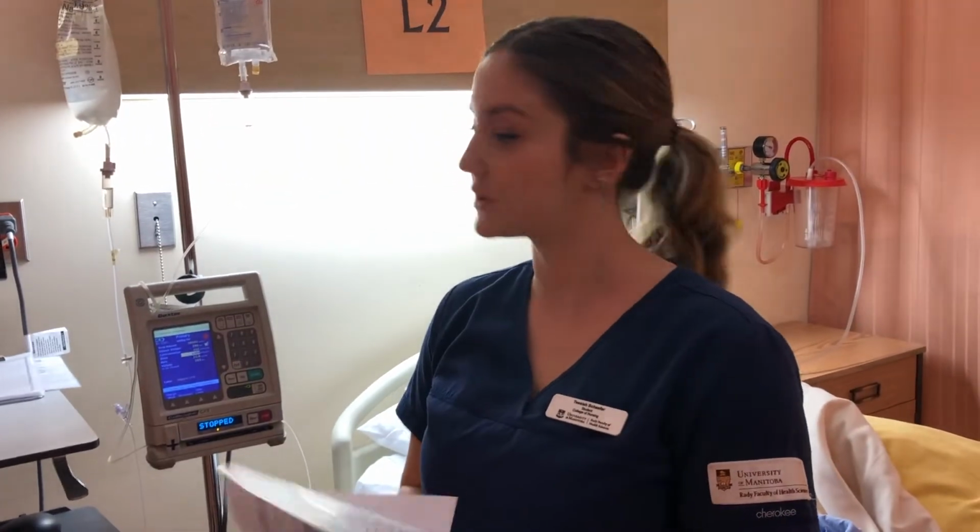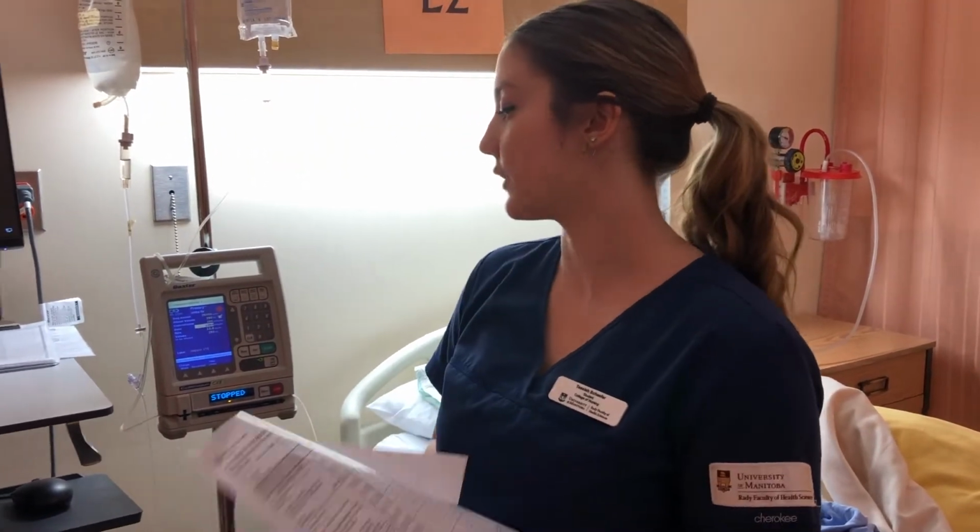So now I would get the second nurse to come do an independent double check to make sure that everything is safe, everything matches, the rate is correct.